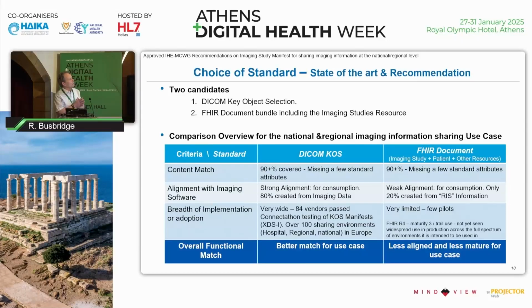Within the multi-country working group, we had quite an in-depth discussion amongst members based on experiences, on the breadth of adoption, the implementation adoption, which is something we can concretely measure at IHE Connectathons. We actually know during the IHE Connectathons which products are supporting what kind of profiles, and what kind of entities underneath those profiles. And when we compare the DICOM KOS and the FHIR imaging study, the state of the art today is that there are far more systems that support a DICOM KOS than the imaging study. So from a maturity and adoption point of view, it's by far the leading technology.